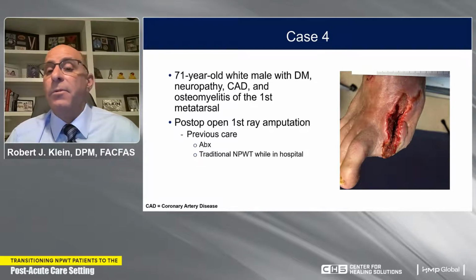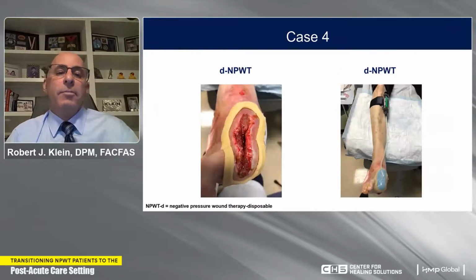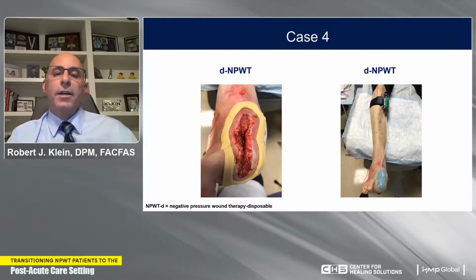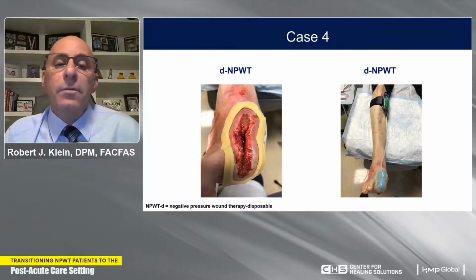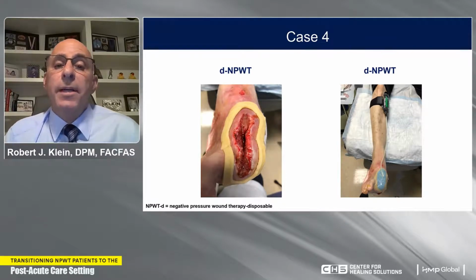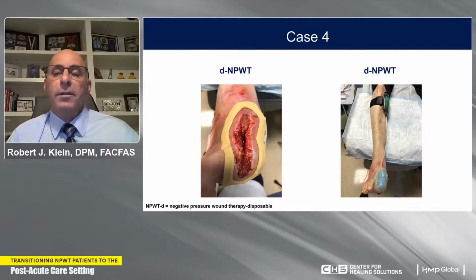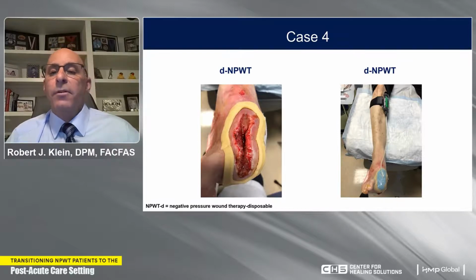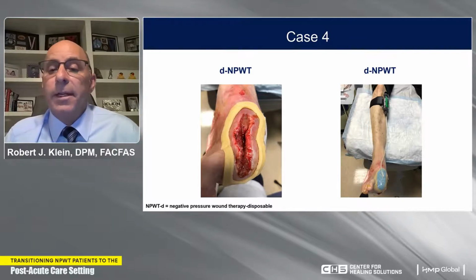And that's exactly what we did do. This is the patient at the wound care center. You can see on the photo on the left, we're putting that hydrocolloid ring 1 centimeter away from the peri-wound. This is a wound that, in my opinion, once again, would benefit from negative pressure wound therapy. And fortunately, we have disposable negative pressure wound therapy that's available. The photo on the right is the mechanical negative pressure wound therapy device that's been applied.